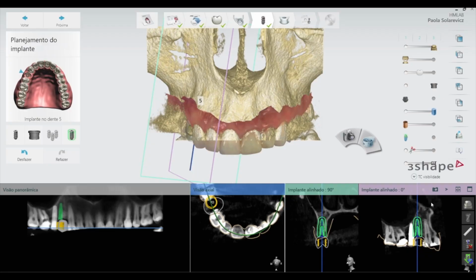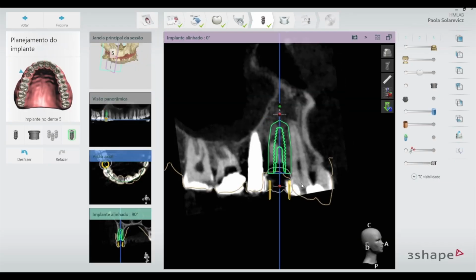Is the digital workflow more efficient than the established conventional pathway for implant-supported crowns? Digital scanning has brought innovative dental treatments, such as computer-guided implantation in combination with CBCT scan or digital impression system, which allows for CAD/CAM-based restorations. Acquiring accurate impressions and transferring intraoral images are important steps for fabricating precise dental restorations. Direct digitalization showed higher accuracy compared to conventional impression taking and indirect digitalization. Due to the elastic properties of the impression materials, indirect digitalization of the impression was not recommended.